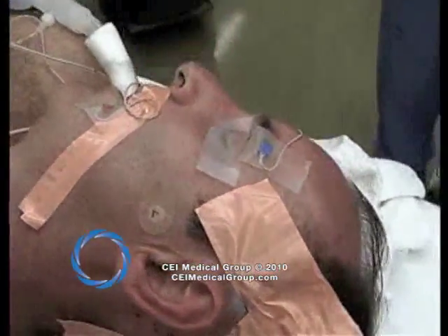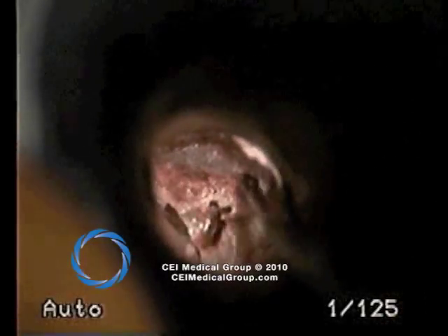You'll notice also that the facial nerve monitor is intact, as over a third of these patients have had dehiscent facial nerves.